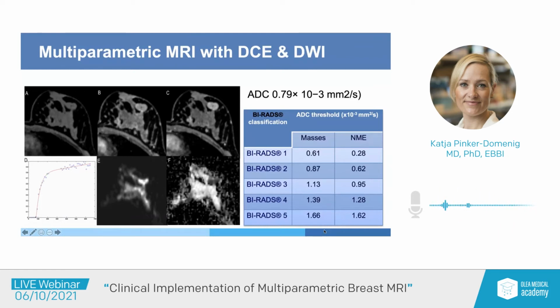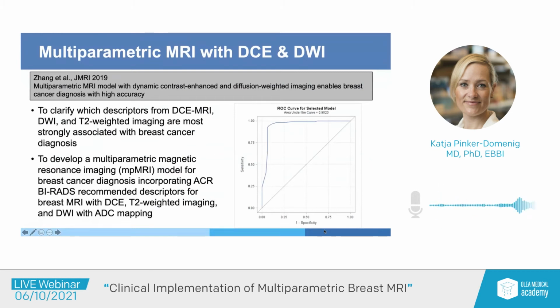And when we saw that lesion, it is continuously enhancing. But on diffusion-weighted imaging, this is a dark hole, and that was quite concerning for us. We actually biopsied that based on that finding, and that turned out to be a breast cancer. So this is one of the things where I was deeply impressed and further confirmed that I should be using DWI.